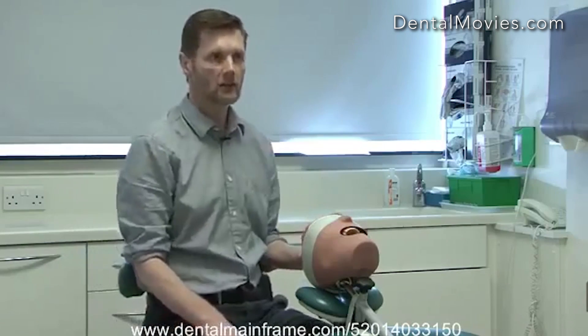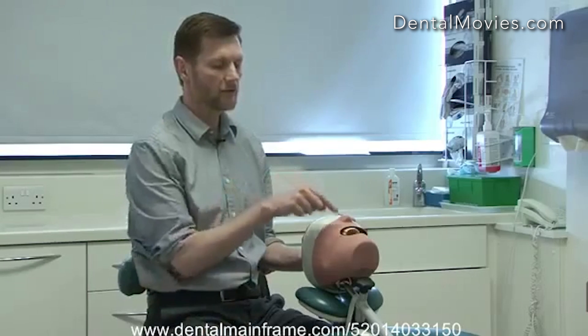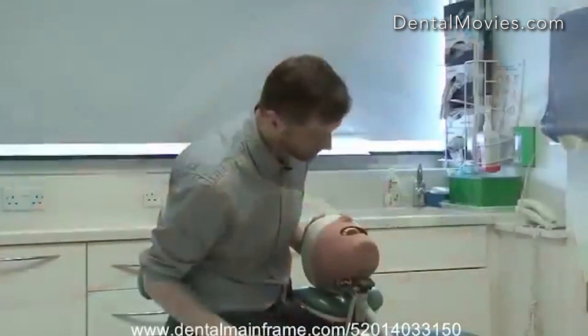Reclining the patient to this degree is not enough. I can see the front surfaces of the top and lower teeth but I won't get access to the back of the mouth. The only way I'll be able to see to the back of the mouth is if I start to lean forward, which is something we want to avoid. So I'm going to adjust the foot pedal to get the patient appropriately reclined.